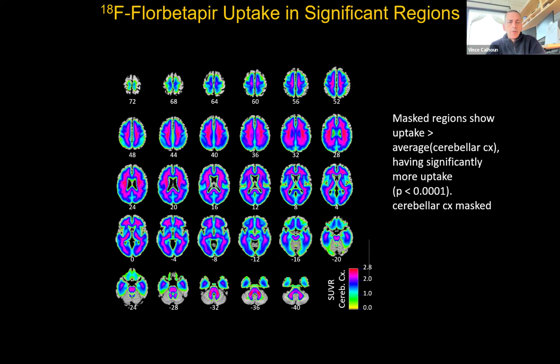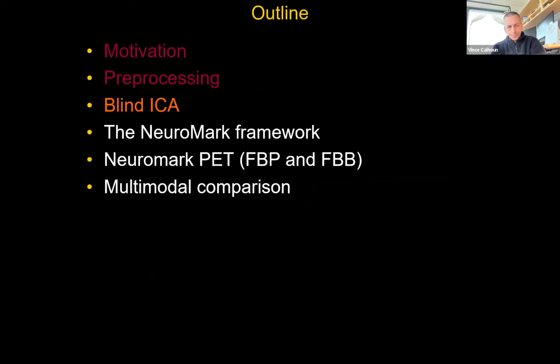And here's an example of what you would get from a florbetapir amyloid image. These are controls, healthy individuals, and you can see that most of the uptake is coming from the white matter. We also have gray matter uptake. In the case of individuals with Alzheimer's, you start to see the gray matter regions show more uptake over time.